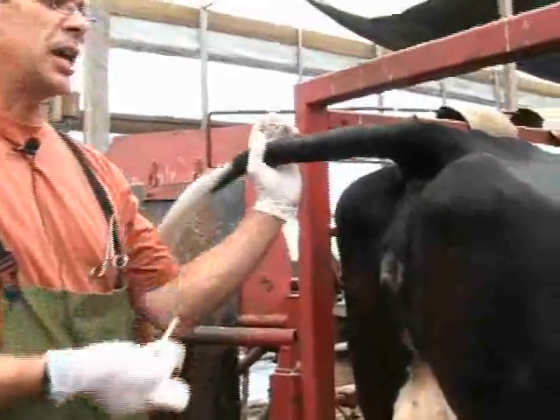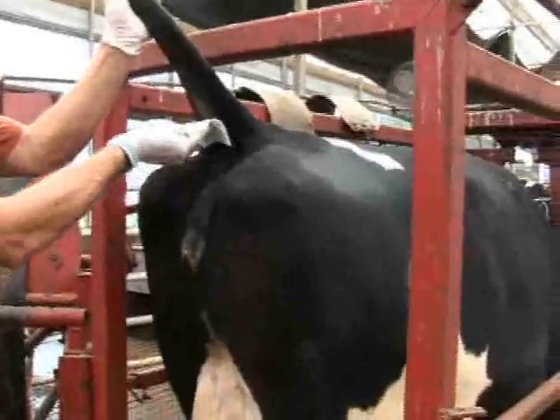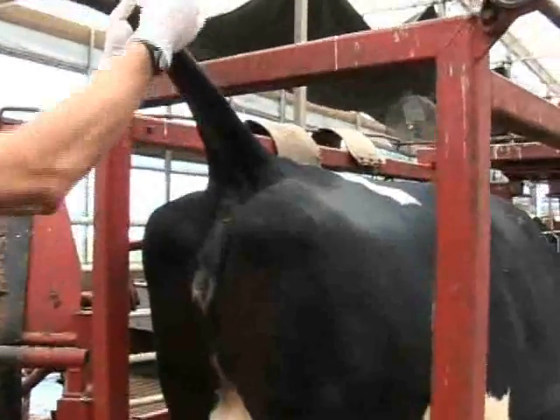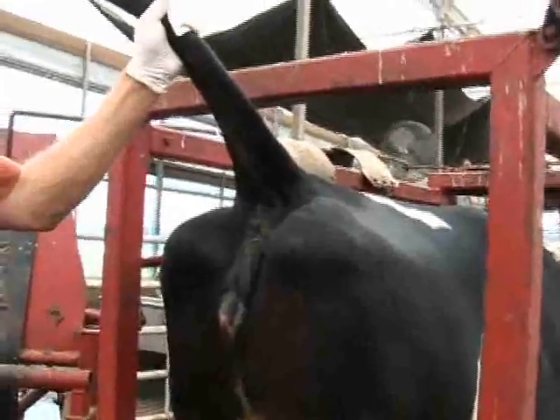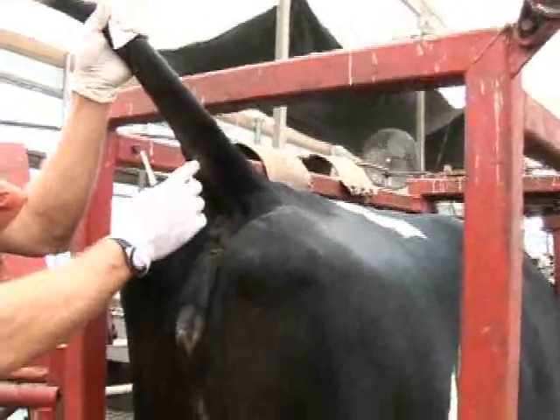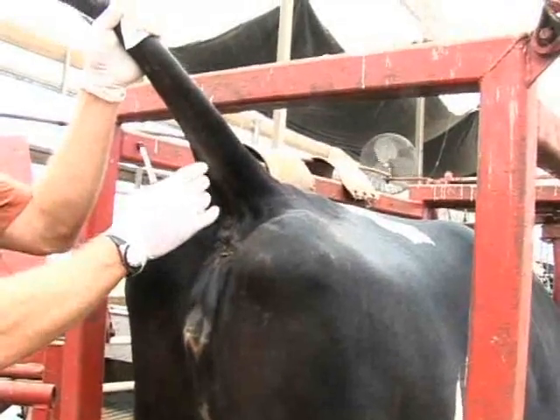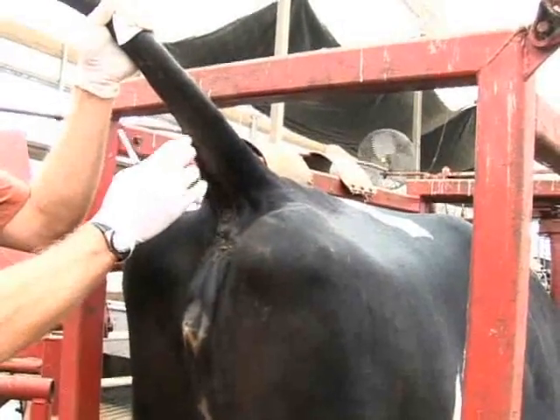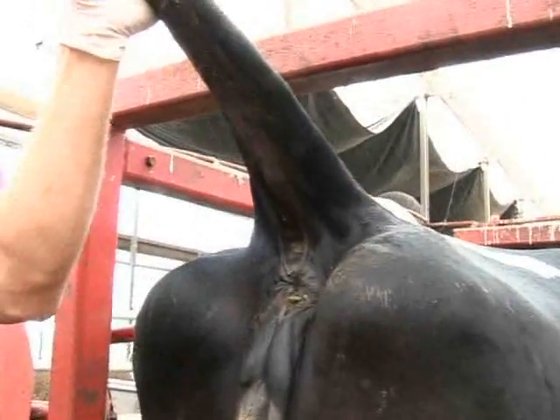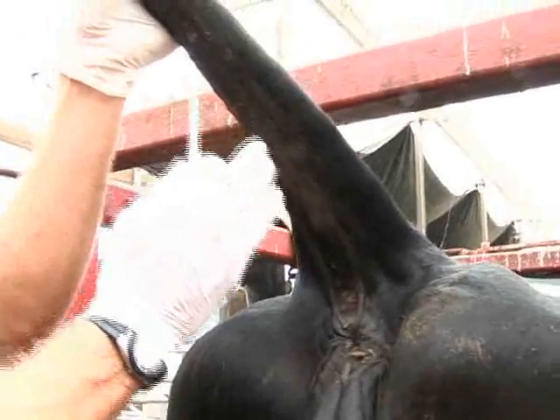We're going to take her tail and lift it straight up, then use a 4x4 gauze to wipe clean the area we're going to draw blood from. The landmark runs right down the midline of the cattle's tail — the coccygeal groove — which can be palpated digitally like this.